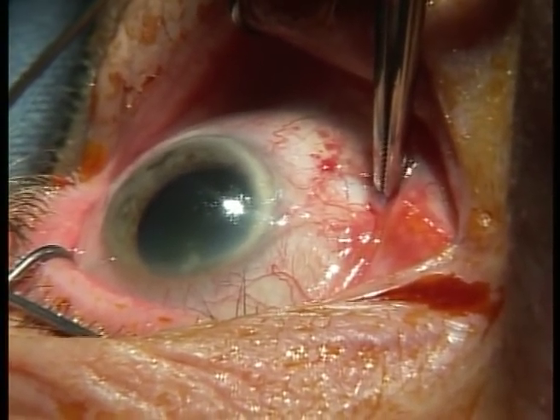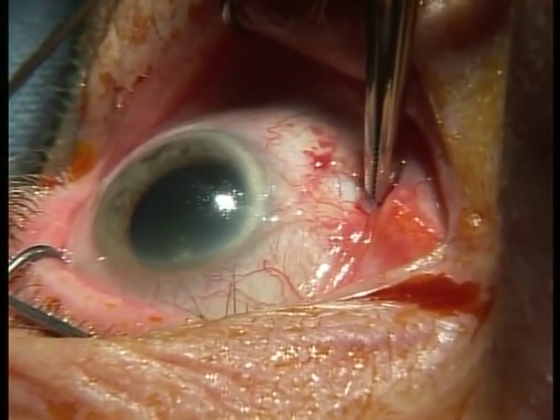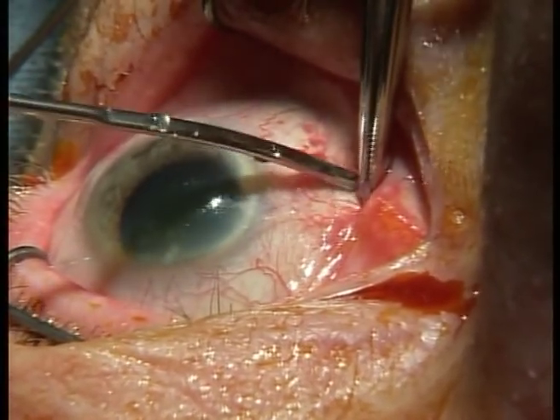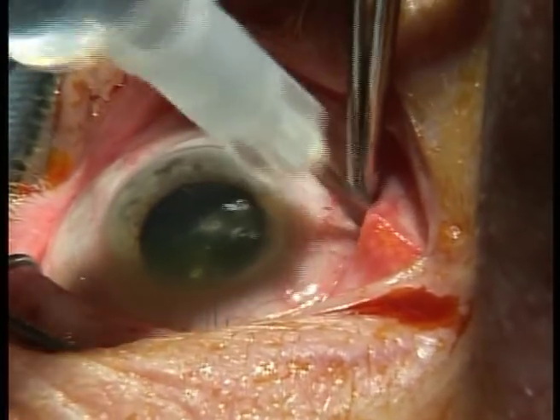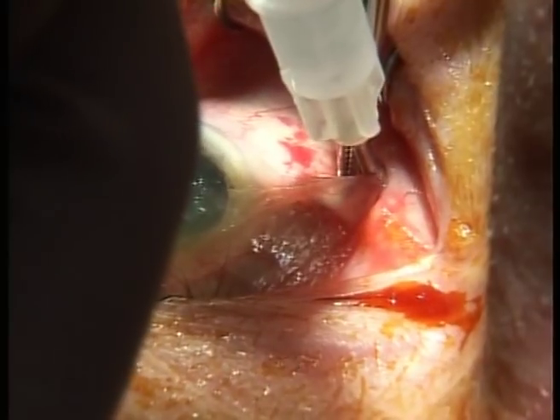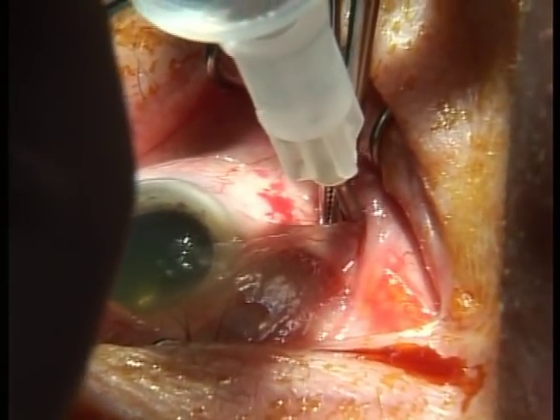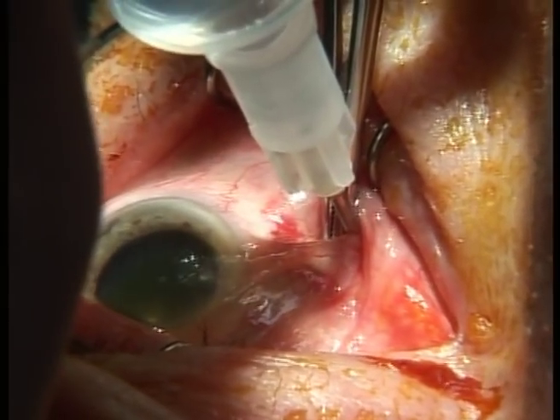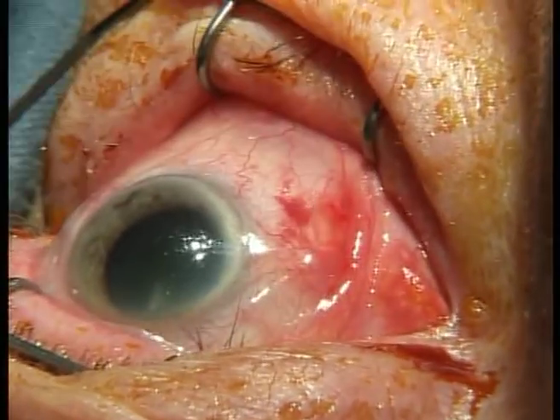At all times now I leave my forceps resting on the globe, not lifting up. Pick it up, I brace myself against the patient's head with my little finger and pass this into the incision that I've made, and now come around to almost vertical and inject the local anaesthetic posteriorly. I rotate the barrel of the syringe along its long axis to spread the local anaesthetic posteriorly and put in about 4 mils. Well done, George, just about finished.